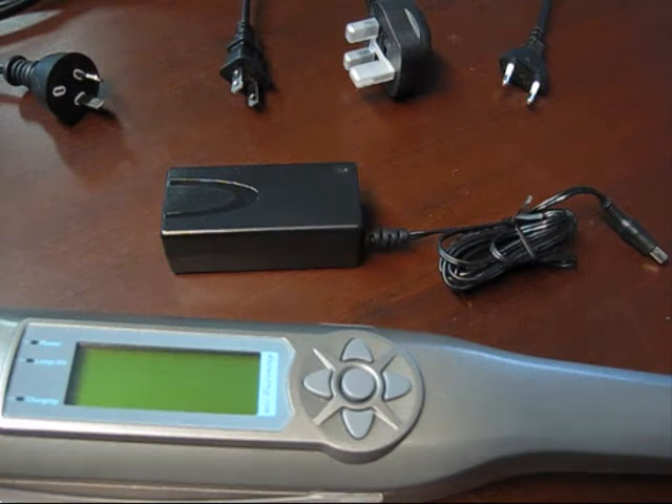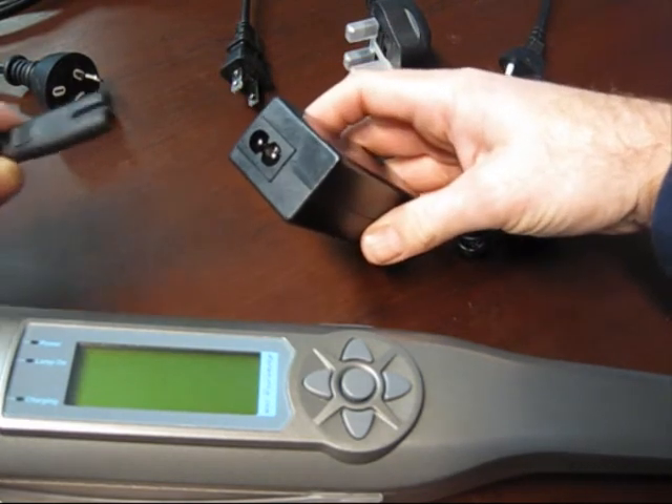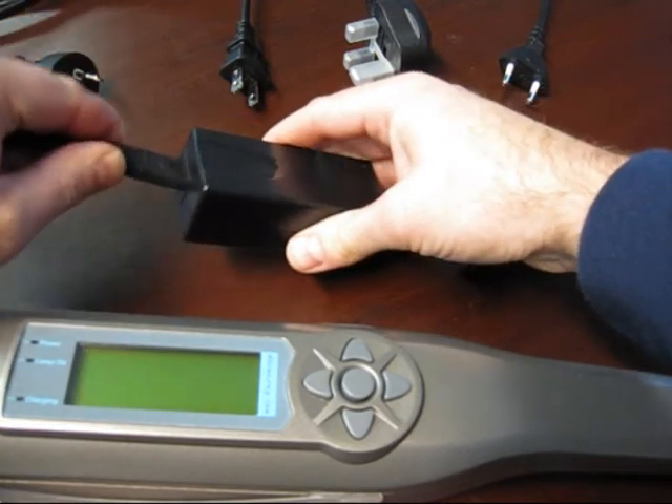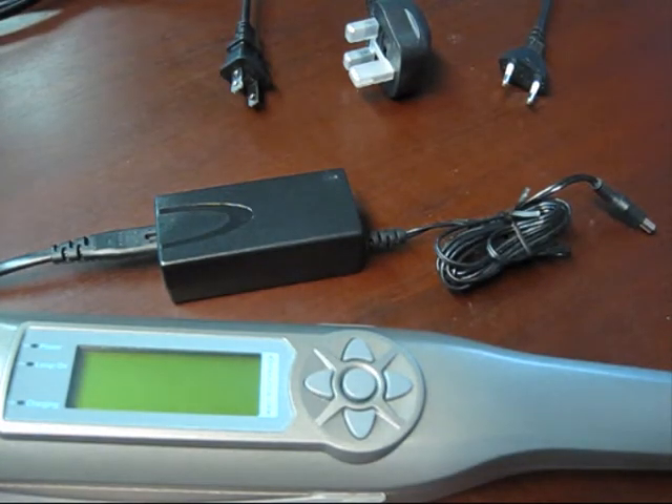Depending on where you're located we'll send you the appropriate cable unless you specifically request otherwise. These cables aren't custom — you can purchase them at any electronics outlet. The end of each of those cables is identical: it's a figure-eight connector that plugs into the power transformer. You then plug the power transformer using the appropriate cable to an electrical outlet.